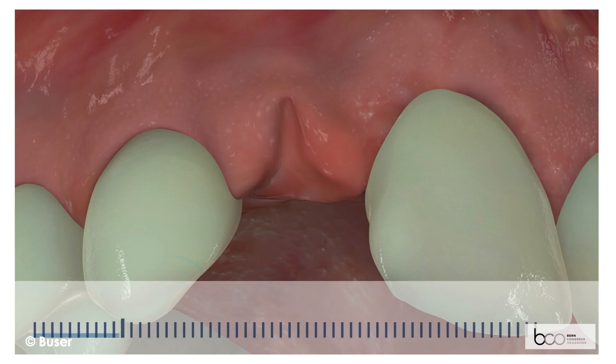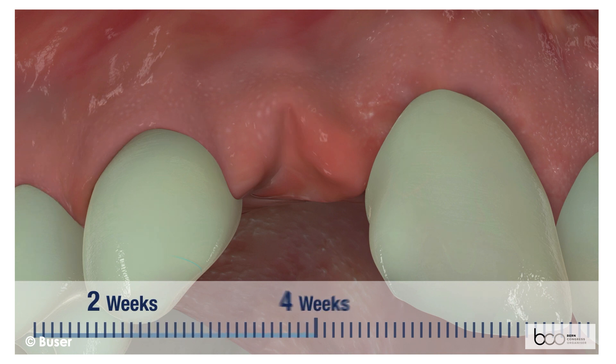During the 8 weeks of socket healing, keratinised mucosa spontaneously forms over the socket. Initially, there is a slight invagination of the mucosa at the crest. Then a gradual flattening is observed on the mid-facial aspect of the extraction socket.